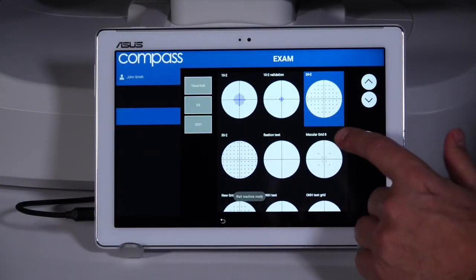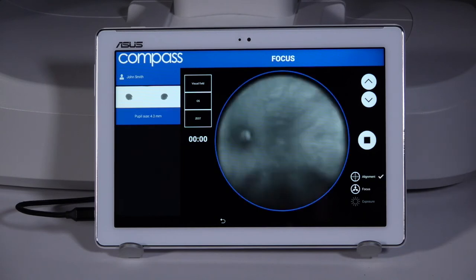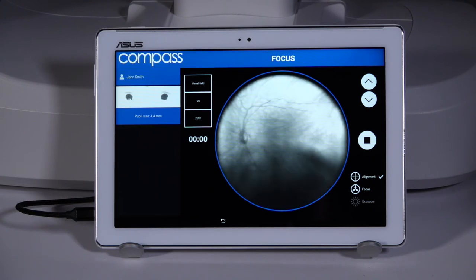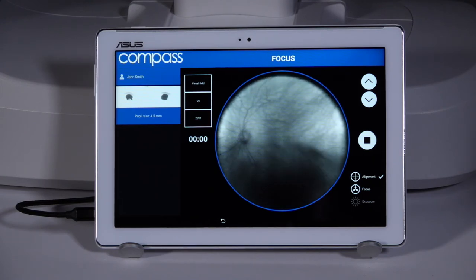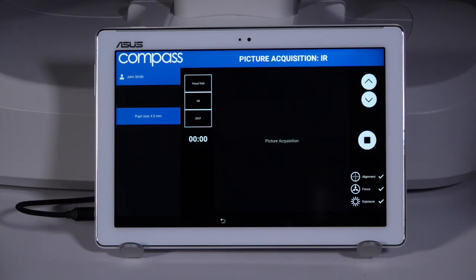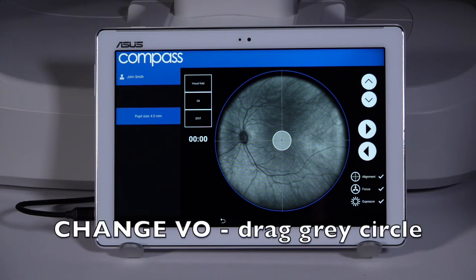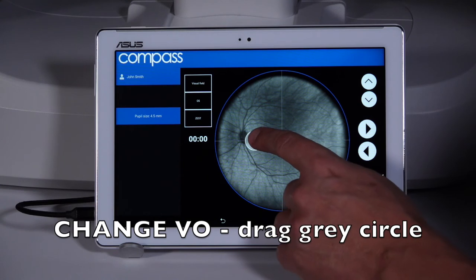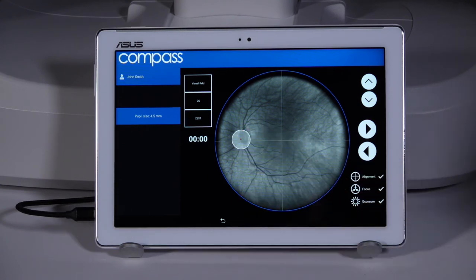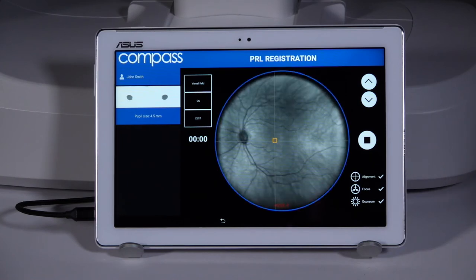Press the play icon on the tablet to initiate the auto-alignment and auto-focusing. Once in focus, the compass will capture the reference infrared image for fundus tracking. It is important to capture a quality image for tracking and to retake the image if necessary. Drag and center the circle over the patient's optic disc, then click the forward arrow. This step is used for blind spot testing.